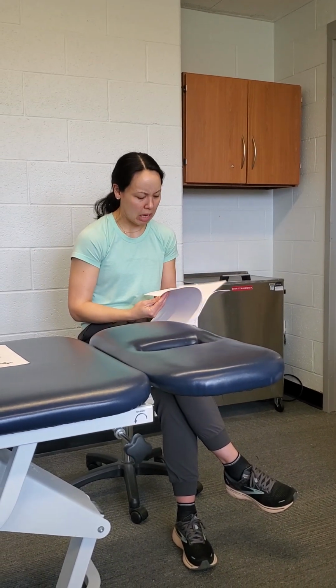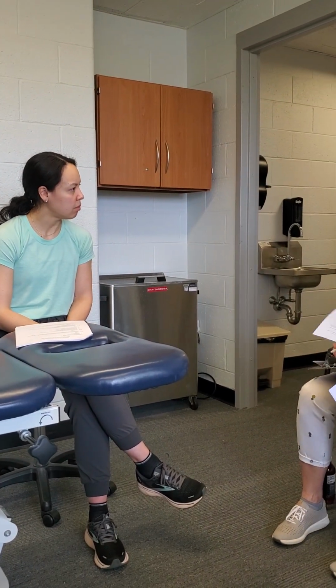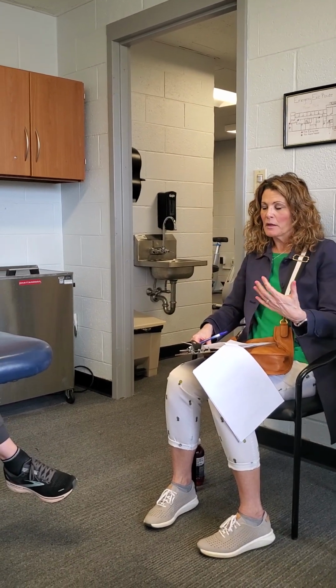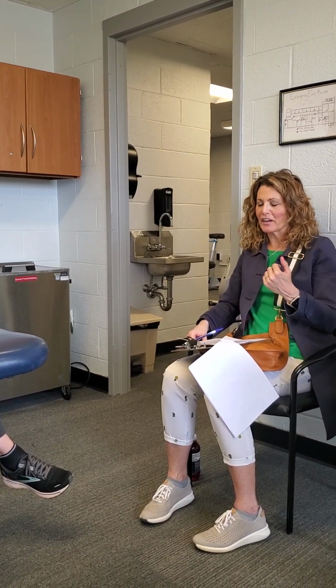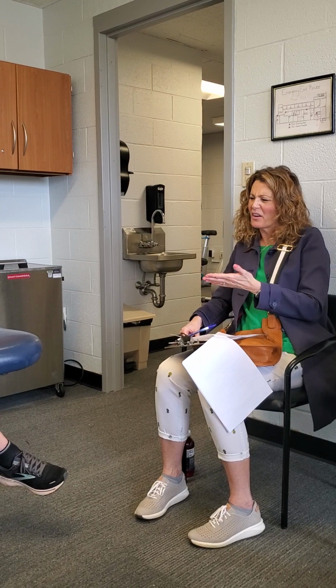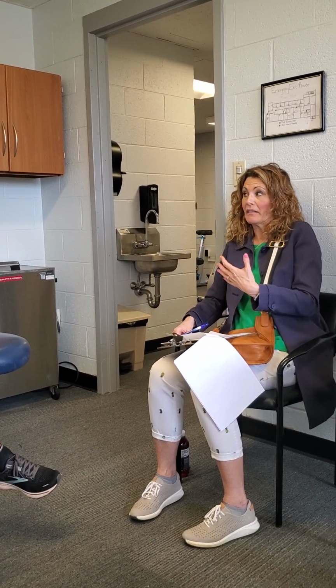Sorry, I know I kind of flew through some of that, but along the lines of the Parkinson's, most of them start with a one-sided weakness that then becomes bilateral. I'm even thinking about the woman I have right now. I assume you would put the BFR on the more affected limb. Probably. But when they talk about Parkinson's, they're noticing bilateral change, even when the device is on one side.